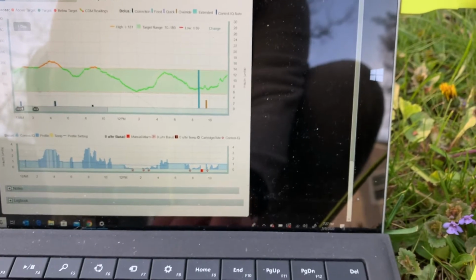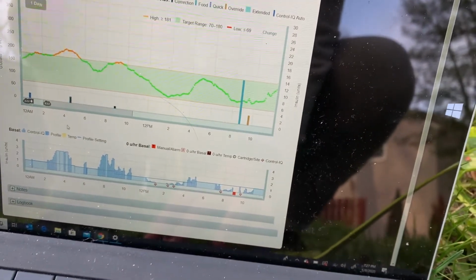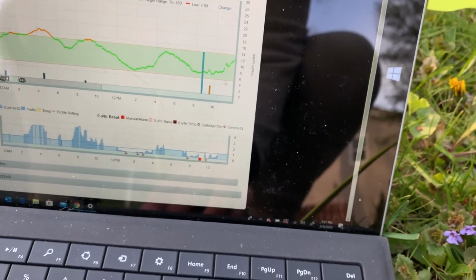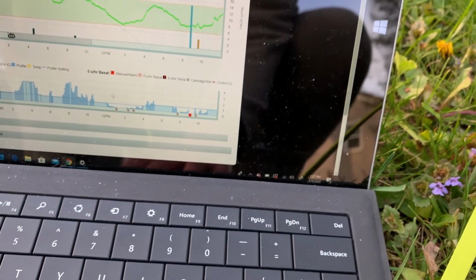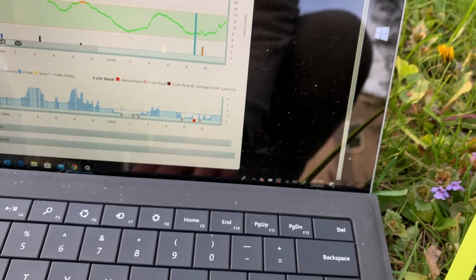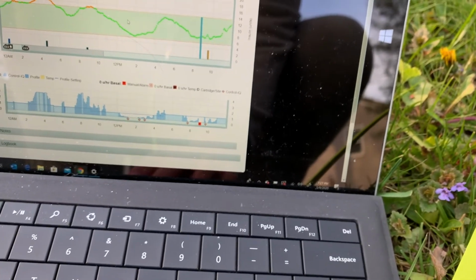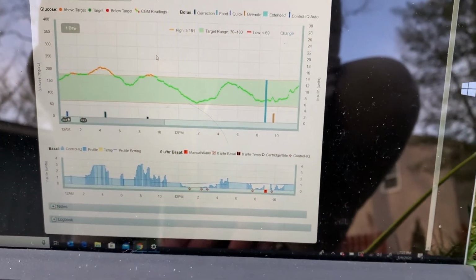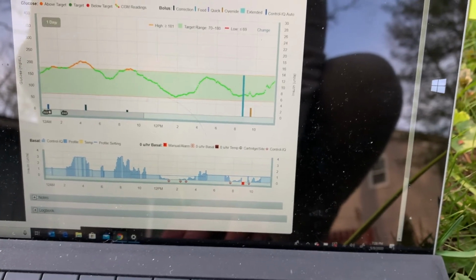So you can tell I kind of went crazy last night, right over here. And I had some high blood sugar, so this is my continuous glucose monitor. And then at the bottom, you can actually see the insulin that my pump gave. These tiny little bars are the basal rates. So you can find a whole bunch of information. You can figure out how much insulin you're using in a day. You can actually figure out what your trends are by clicking on the trends button.